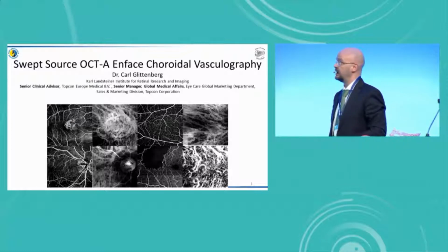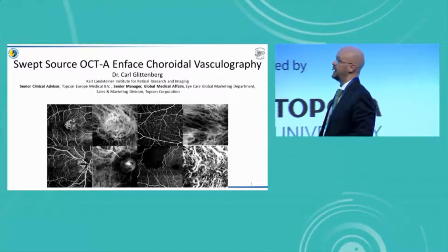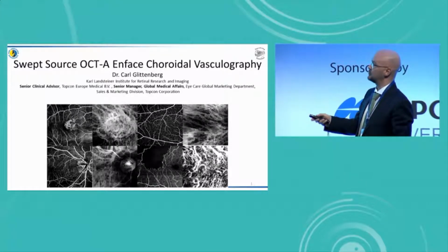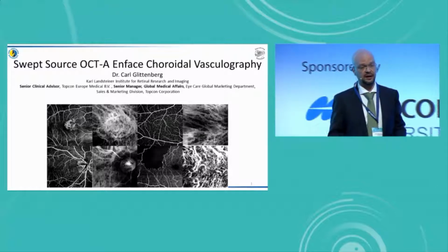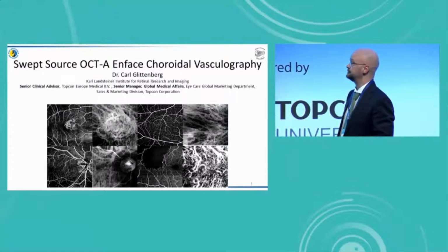Okay, on to the next topic, which is very similar to Peter's. I'm going to be discussing swept source OCT-A Enface choroidal vasculography to see if it's possible to actually visualize the choroid in a different way using the data that we have in swept source OCT.